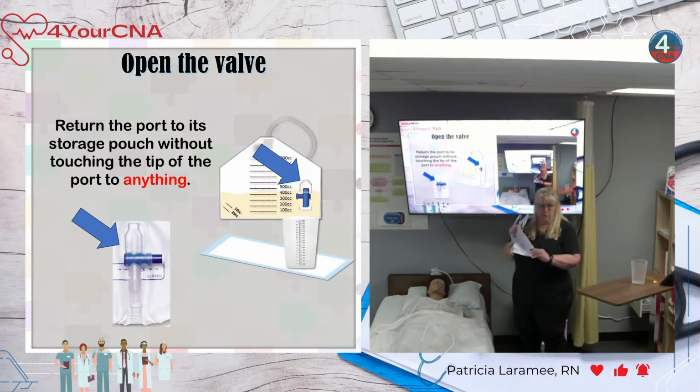It gets removed from its house, opened, emptied, closed, and tucked back up into the house without touching anything. Do you guys see how I put it right back into the house without letting it touch anything? And I can't even see it. Okay. You have no excuse. Okay. Good? Yeah.